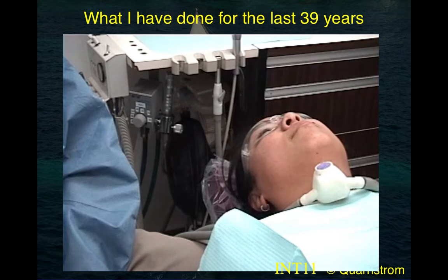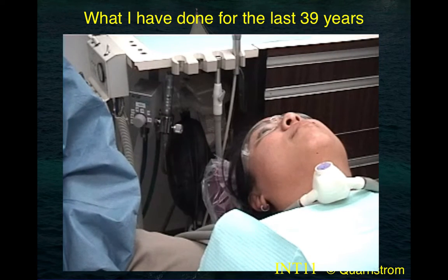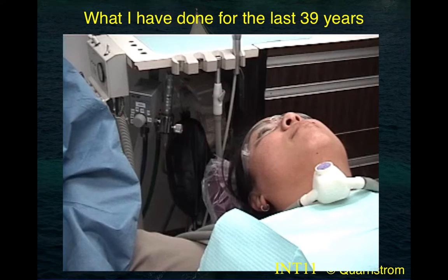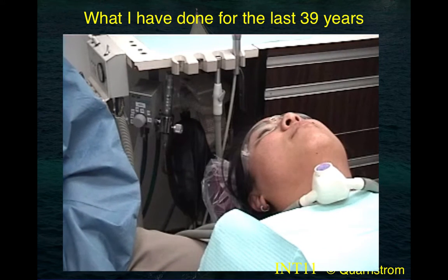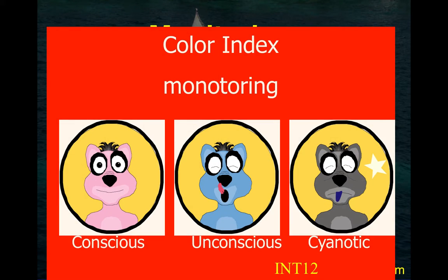She, at that point, would be a little sedated, and she would be more in just sort of dozing. If you're having to pinch her to wake her up, you've gone way, way too far. Now you're approaching general anesthesia, and we don't want to do that. There are various hazards that come along with anesthesia. Go ahead and shut it off. Okay, so that's, I think, a reasonable demonstration of a very simple, very quick technique.